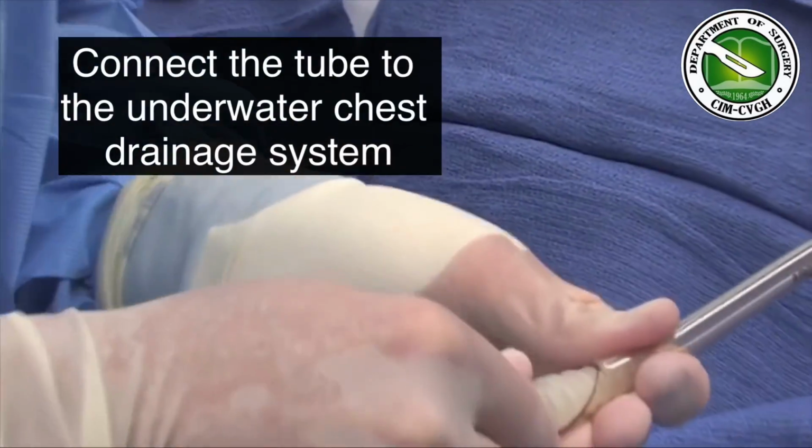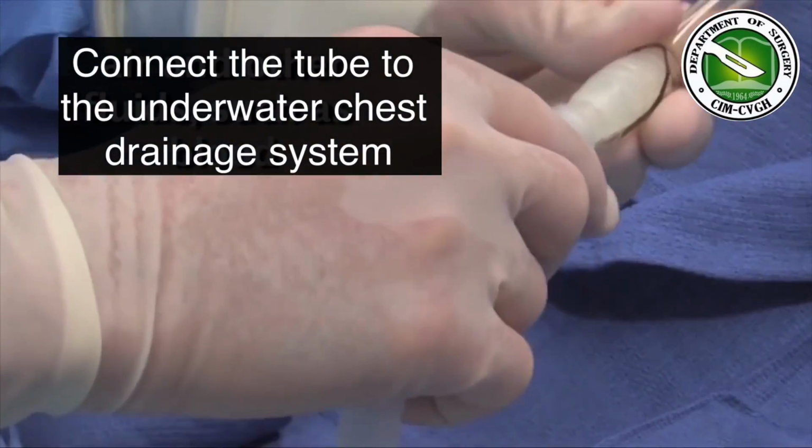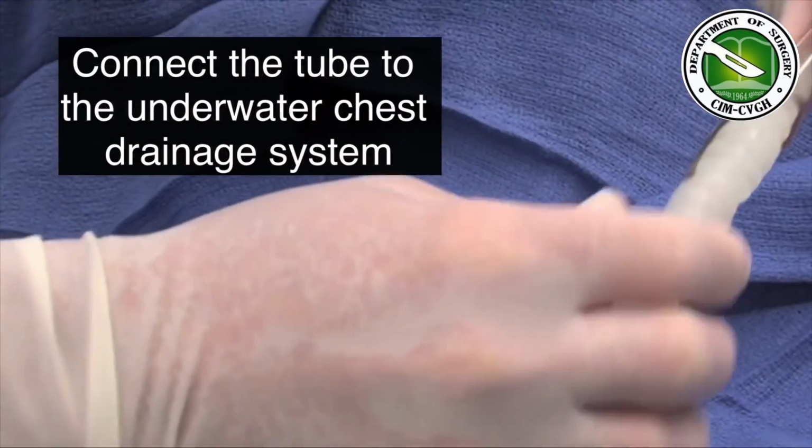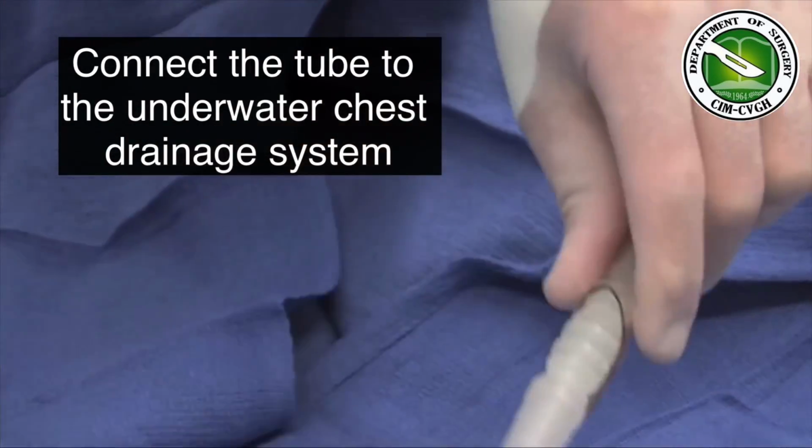Connect the tube to the underwater seal chest drainage system. Care should be taken to do this step properly, as this may cause pneumothorax if the tube is disconnected from the underwater seal.